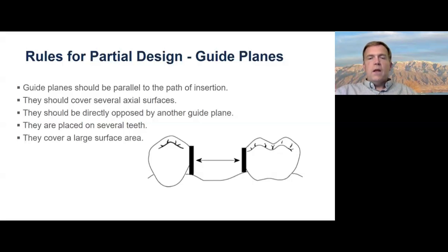Like I said, sometimes partials, we think of them as kind of frustrating or boring or whatever, but they could definitely be an avenue for us to use our creativity, because we're looking at the case and saying, how can I make a minimalistic design on this where all the components work together to make this as stable and comfortable for the patient as possible?